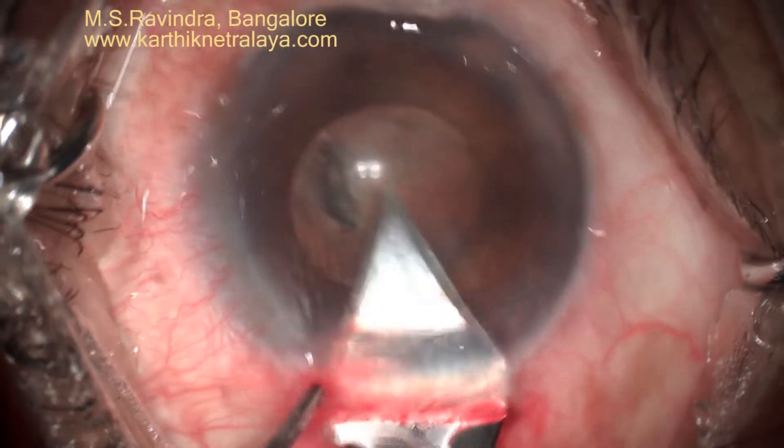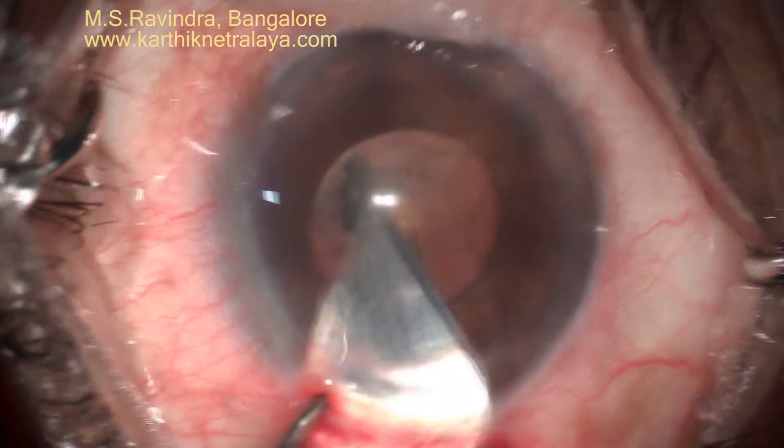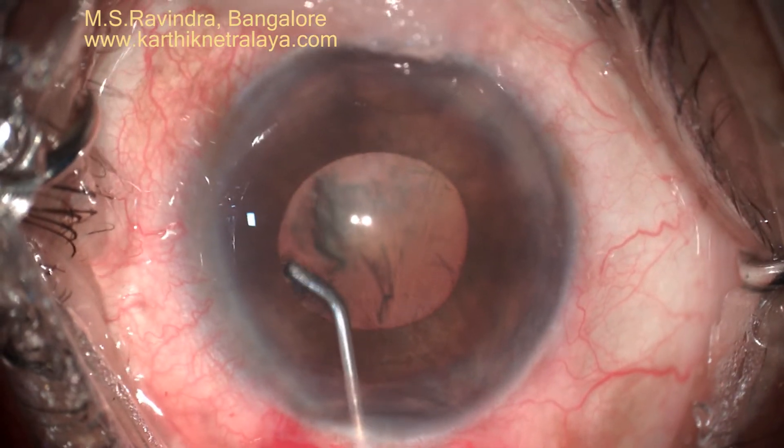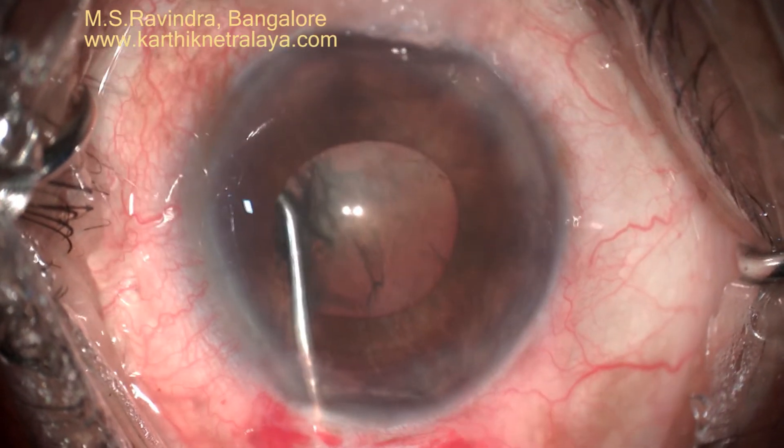This is 1% lignocaine being infused on the surface of the iris. The surgery is being done under topical and intracameral anesthesia.